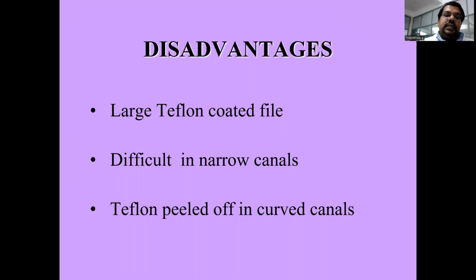The disadvantage is that in a large canal, with a large Teflon coated file, or in a narrow canal, the Teflon peeled off in curved canals.